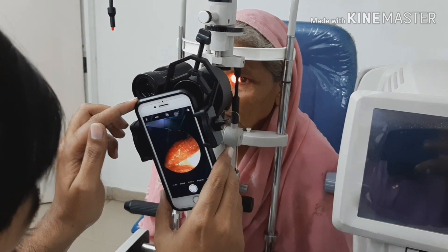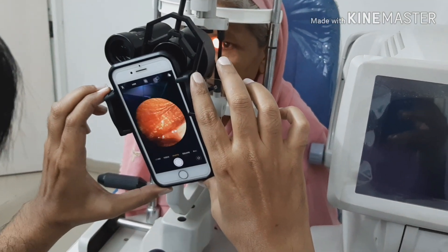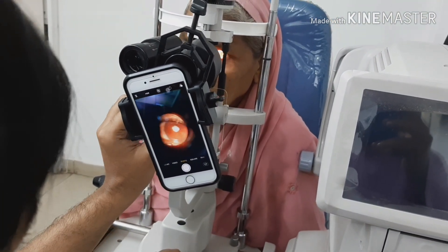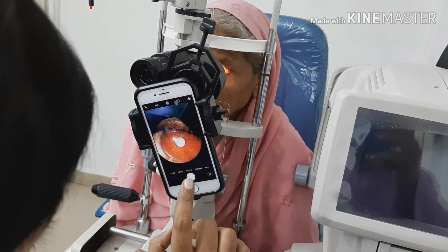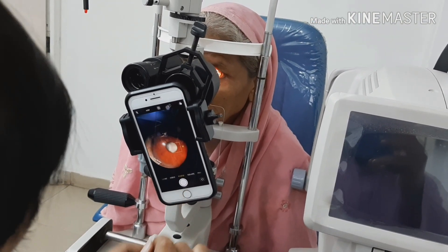A few trials can make you really perfect in this maneuver. You need to take a few trials, but once you do, it becomes really easy. Once you've made a really good image, you can take the photo. You can also zoom in and out to maximize and minimize as needed.